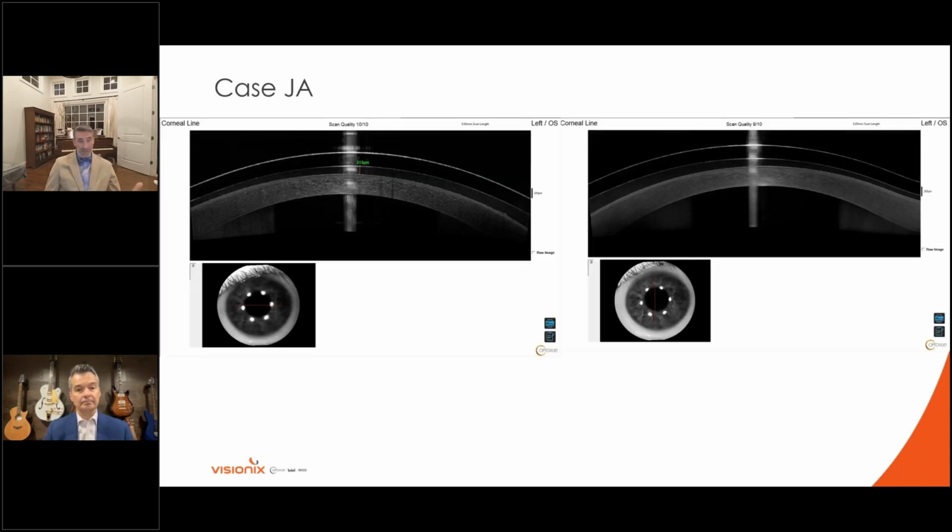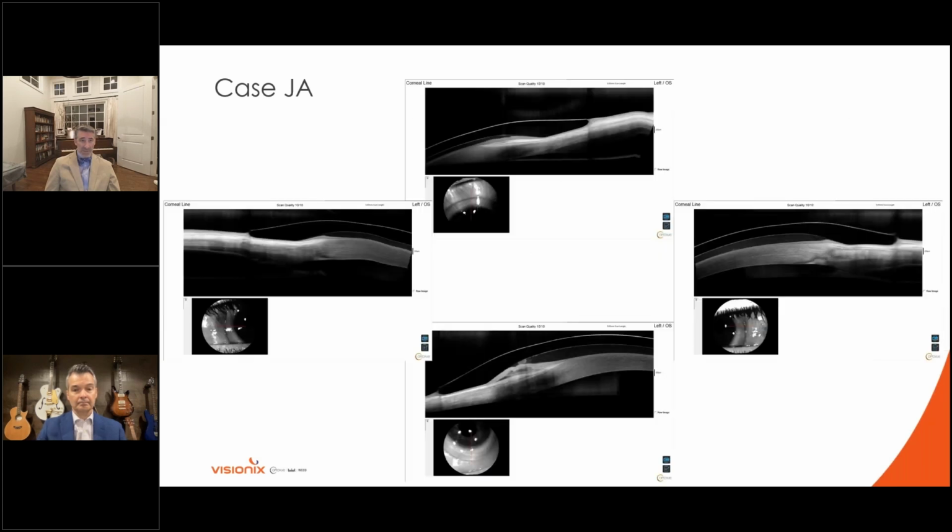When you look at the scan of the central cornea, whoever fit this person, it looked like it was a pretty good fit. If you look real closely, you can see there's 213 microns of clearance horizontally and about that vertically. So this person at least knew a minimum of what they were doing, but you can tell by these OCTs that the person that fit them was just a real jackass, and they just didn't.